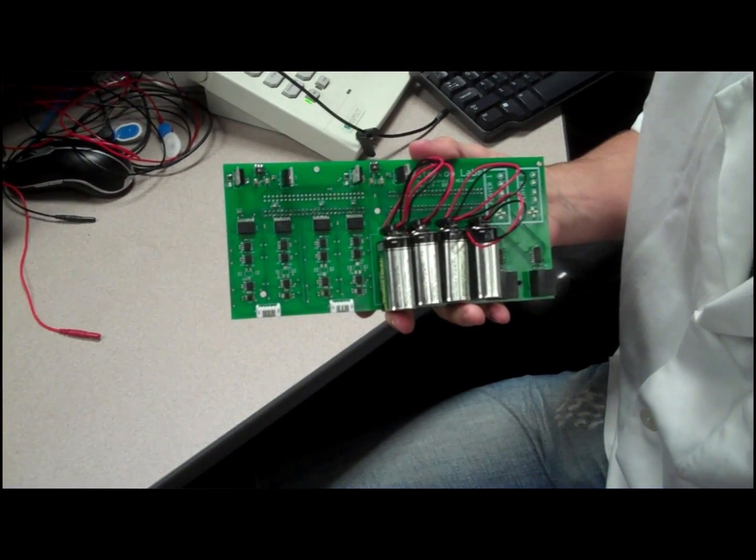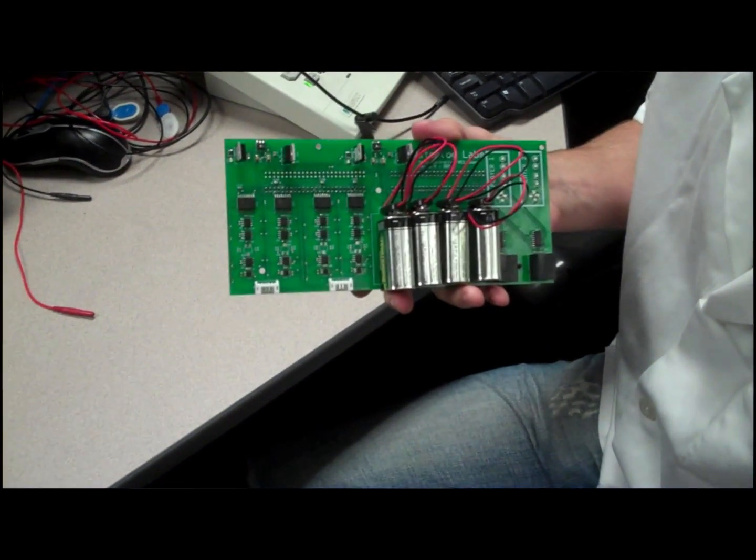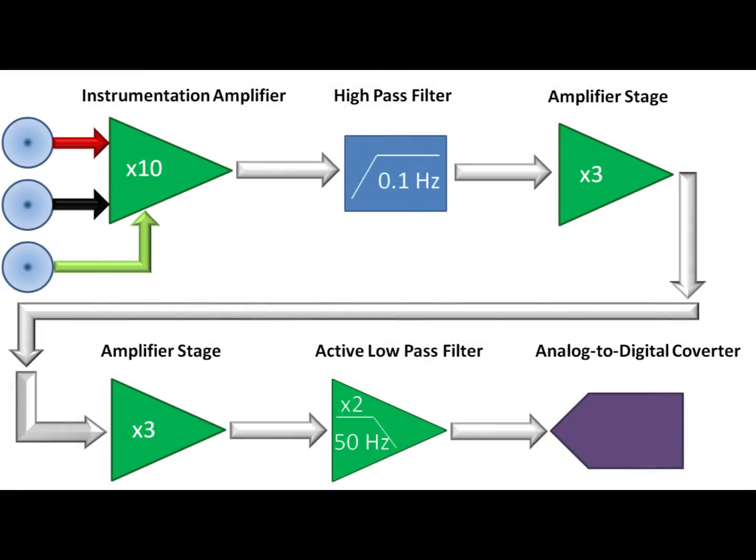Our signal has a potential difference between electrodes, but our interference should be about the same for each one. So if we can amplify the difference between the electrodes and reject everything common to them, then we have our signal. To do this, we need a high-quality differential amplifier. The one we're using is the Analog Devices AD8221 Instrumentation Amplifier — it's low noise and has a high common mode rejection, so we can get the signal we want.